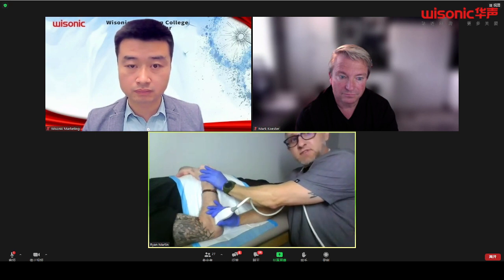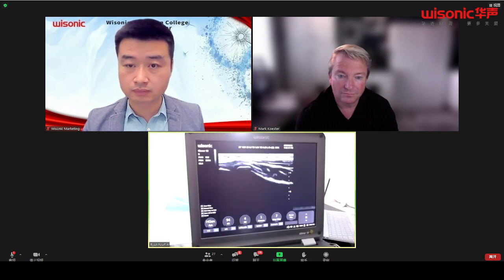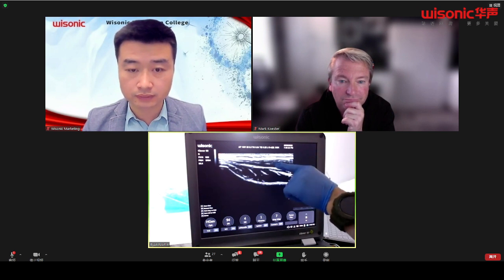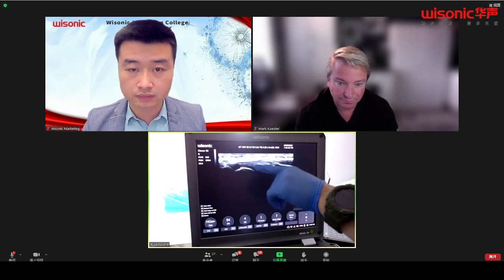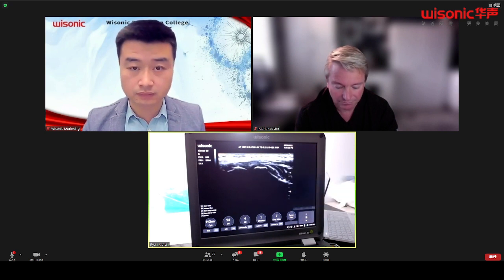Resist that. And on the screen, what you'll be seeing is right on that junction right here. Go ahead and push, push, push. You can see these fibers contract and relax. One more time, sir. Right in there. And right there, you can determine whether or not there's any delamination, any tears, or anything else going on in here.